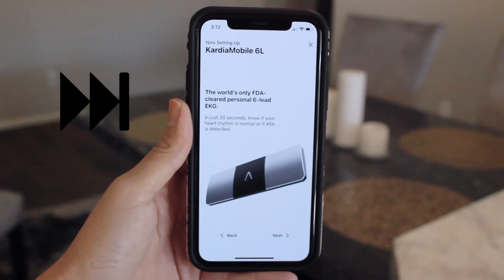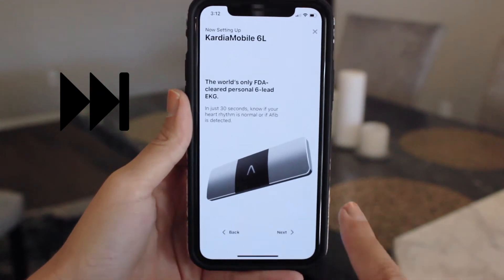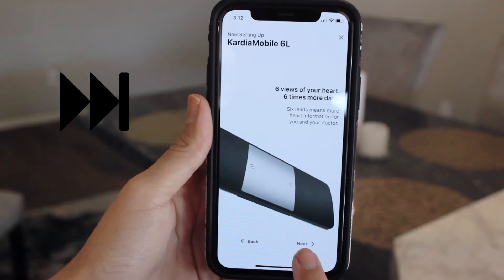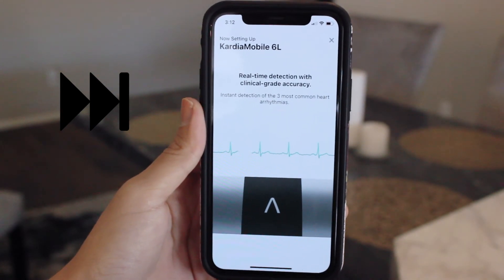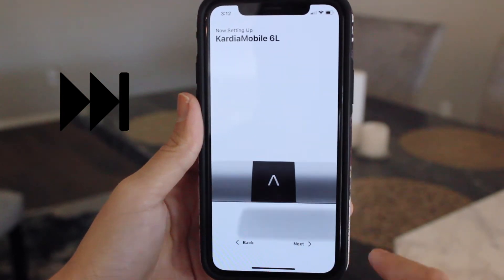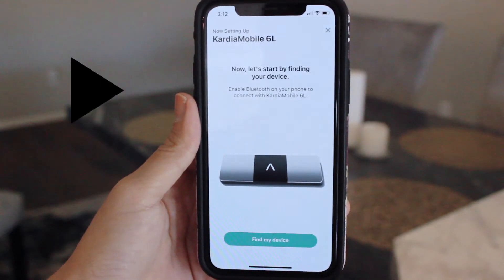The next few slides will go into further detail about your Cardia Mobile device. If you want to click on the screen, please feel free to pause this video and resume it once you've reached the end and see the page that says find my device.